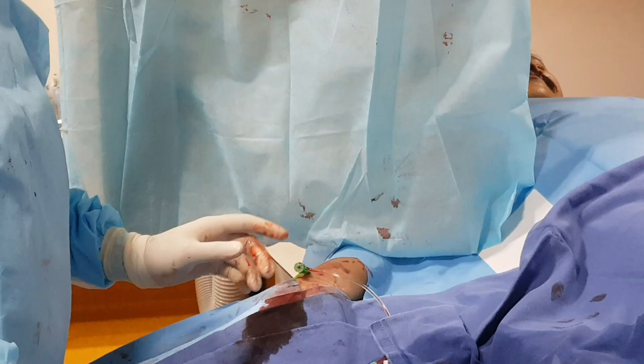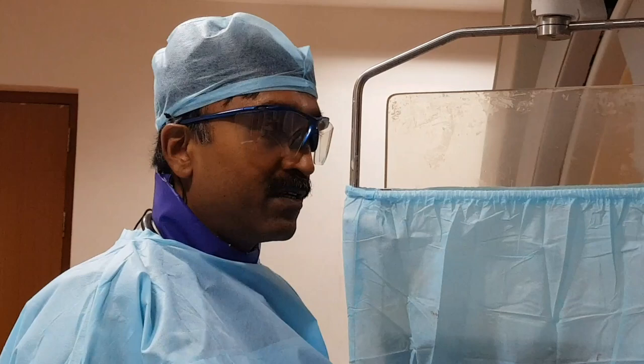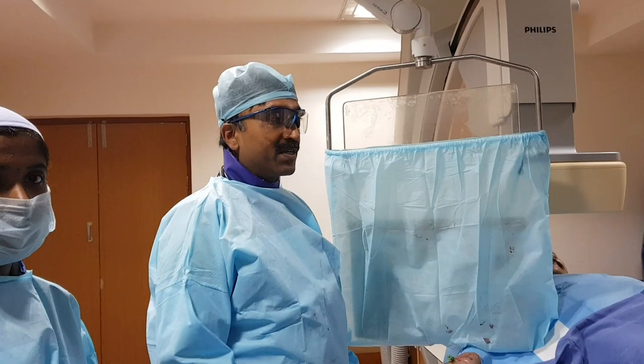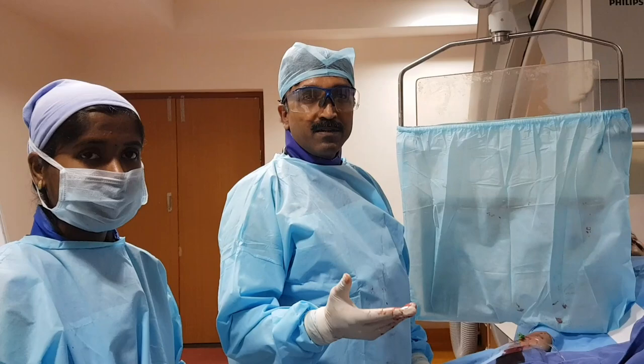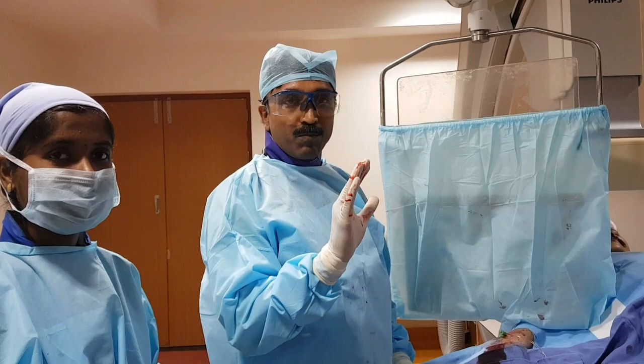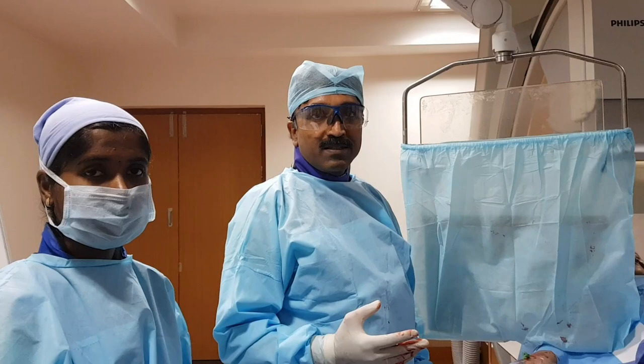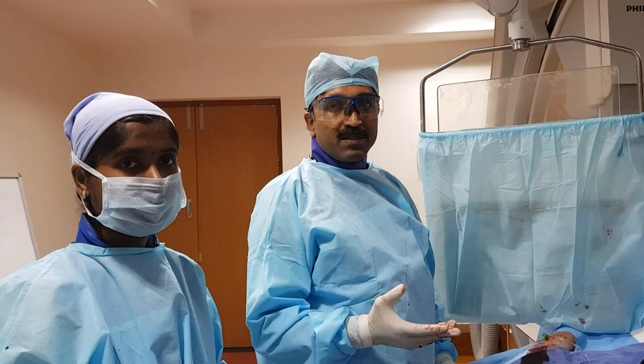The patient will be discharged in another 24 hours. We will observe him in the ICU for a day to see whether there are any complications — the complication rate is one to two percent, which is why they need continuous monitoring. This was a type A lesion, one of the simplest angioplasties. But we do complex angioplasties like graft interventions, rotational ablation of calcified vessels, bifurcation angioplasties, left main angioplasties, and chronic total occlusions — a wide variety of complex lesions.